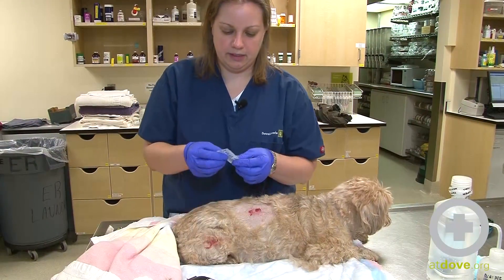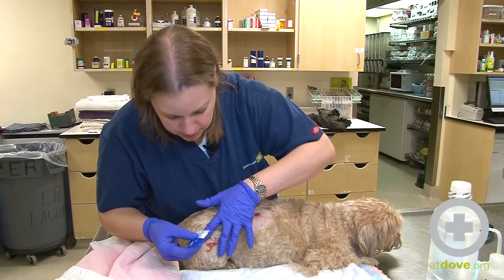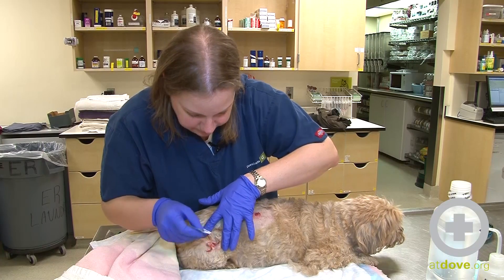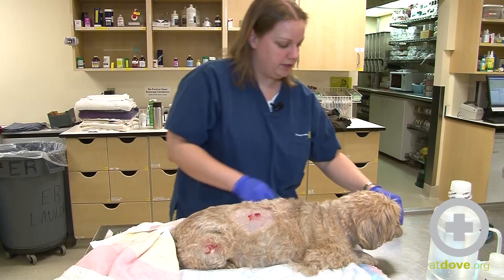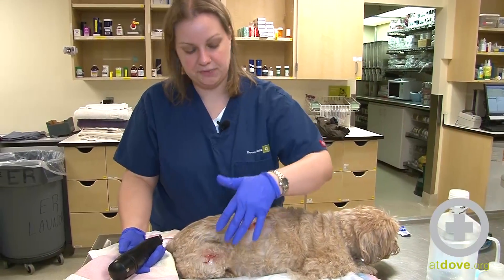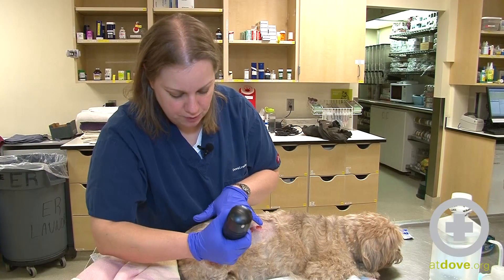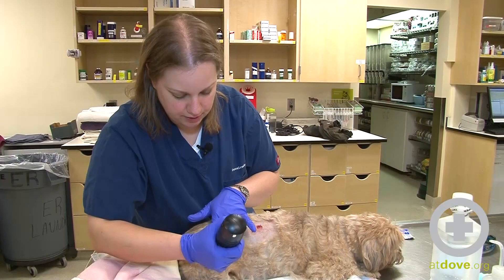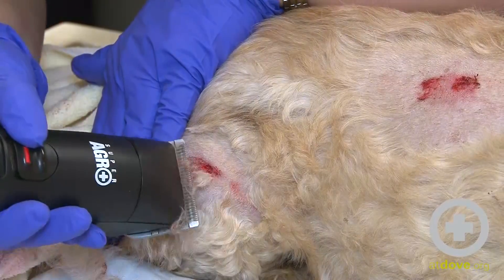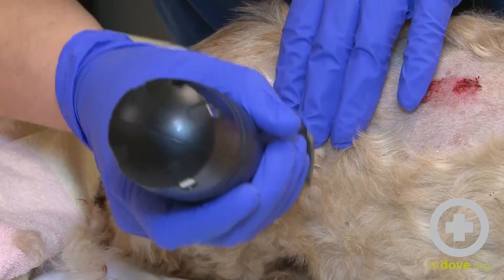In larger and deeper wounds it's a good idea to apply sterile lubricant to them before you clip. I'm just going to slide some of that in there. What the sterile lubricant will do is prevent hair that I'm clipping from sticking to this wound and making it harder for us to clean it out later. This is a water-based lubricant, so it will wash out when we flush the wound — it keeps the tissues moist and prevents hair from sticking to it.